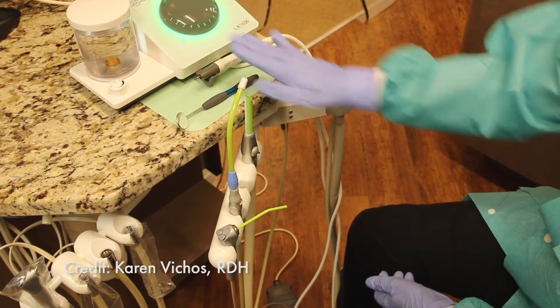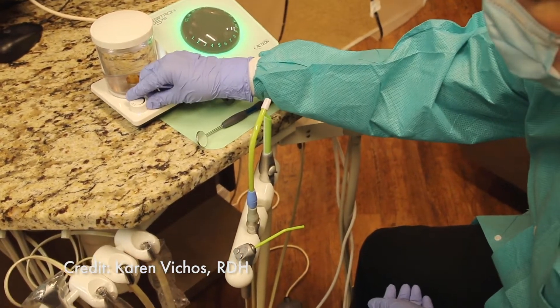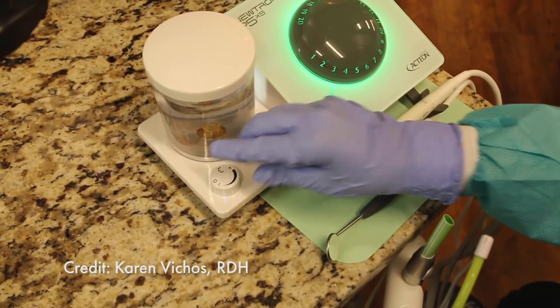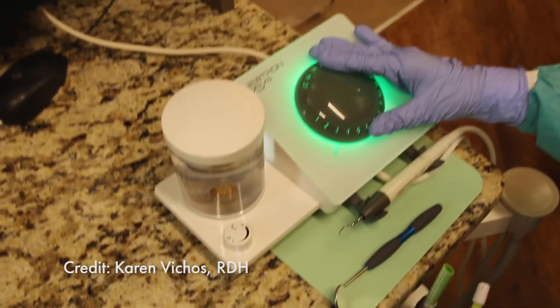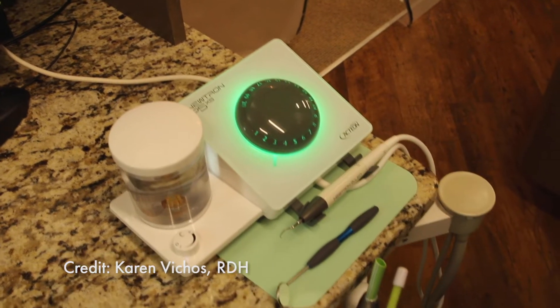First thing I like to do is check my water level in my tank to make sure I have an adequate amount of water. I also like to make sure that my water is turned just slightly to the right — we don't need a lot of water, and I like my dial to be between 3 and 4. This is the range that I like to work at.